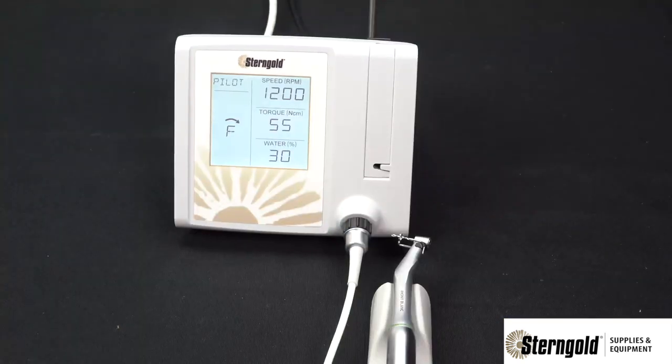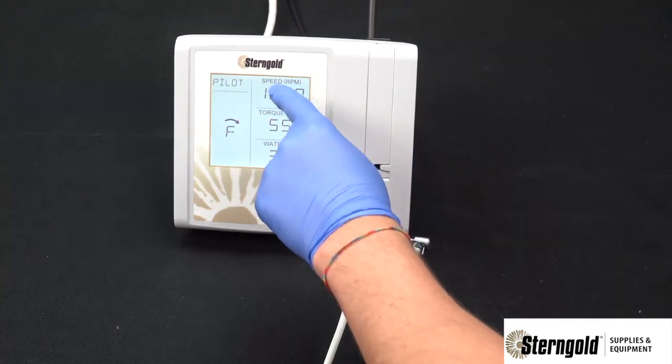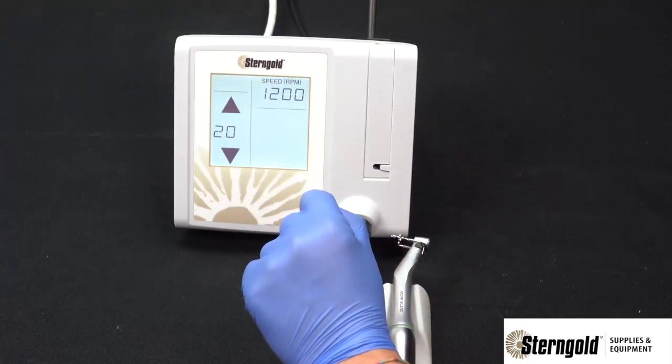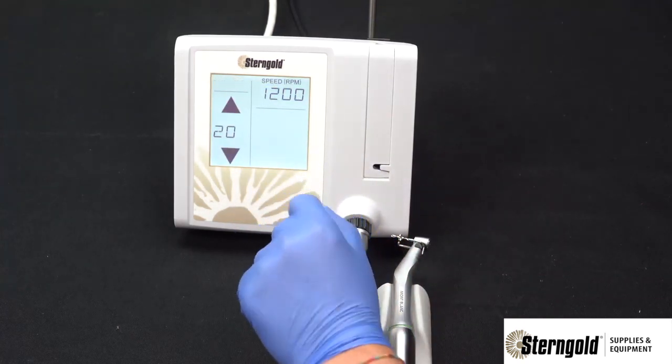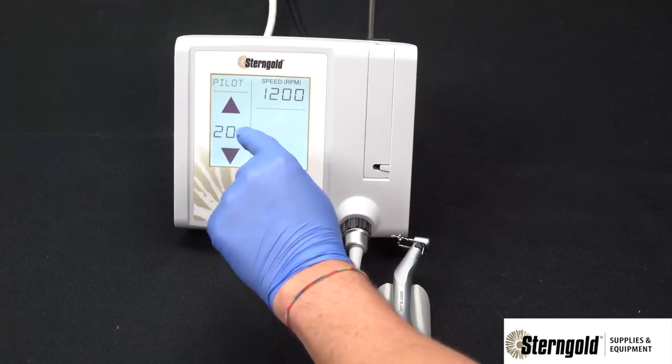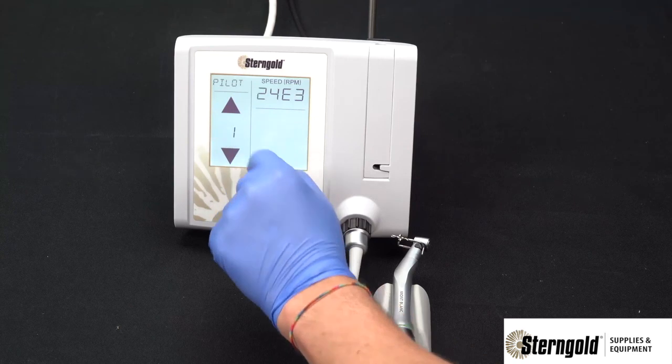This unit is compatible with 20-to-1 reduction handpieces for implant drilling and placement, and also compatible with a 1-to-1 handpiece for basic oral surgery procedures. To change the handpiece ratio, press the speed section of the display to go into the speed adjustment screen, then press the ratio selection area to switch between 20-to-1 or 1-to-1.